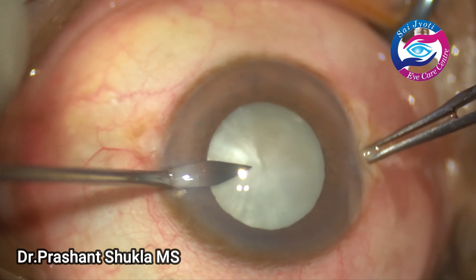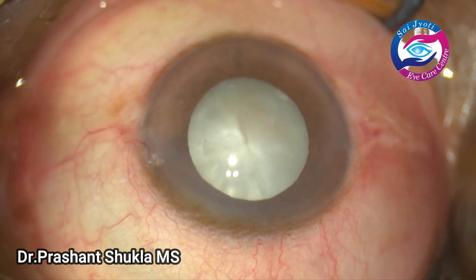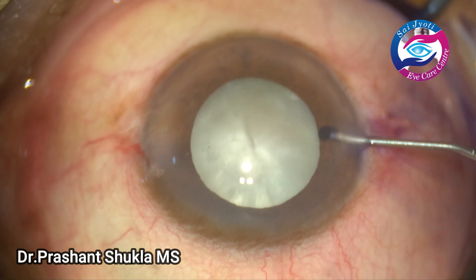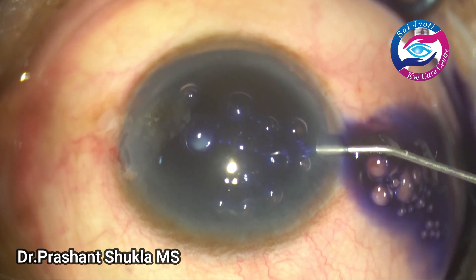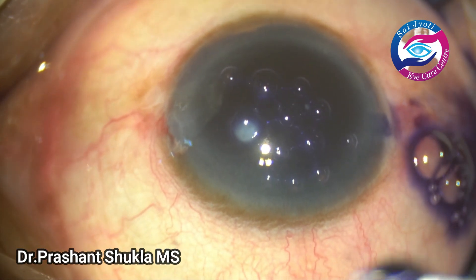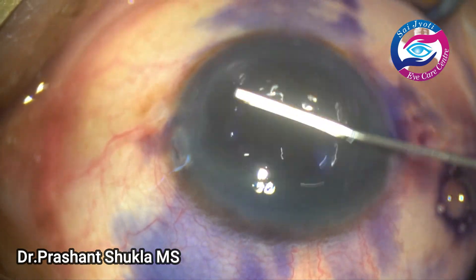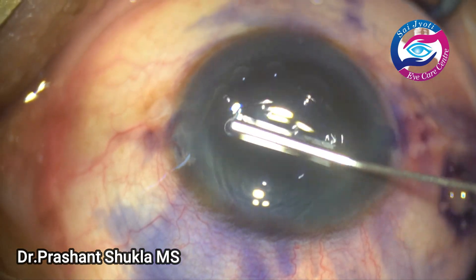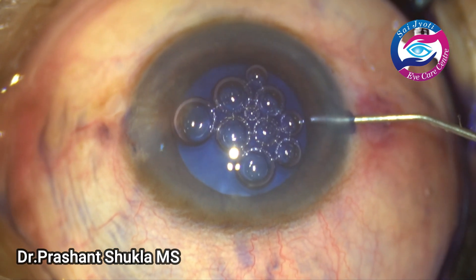By this time side ports have been made and now I am going to stain the anterior capsule with Trypan Blue under a few small air bubbles. Care is taken that the dye is evenly distributed.